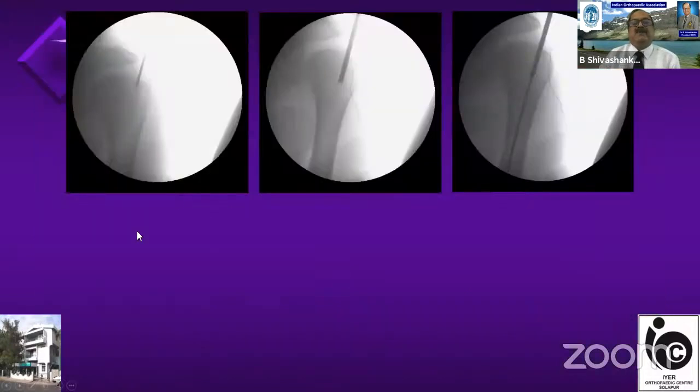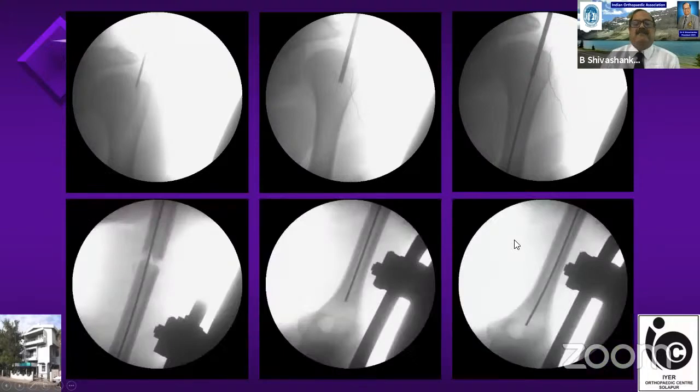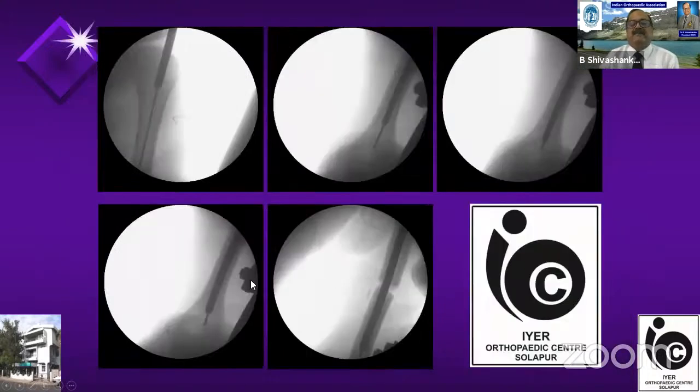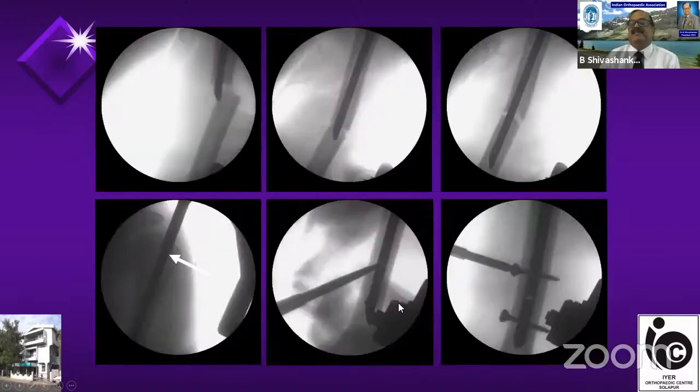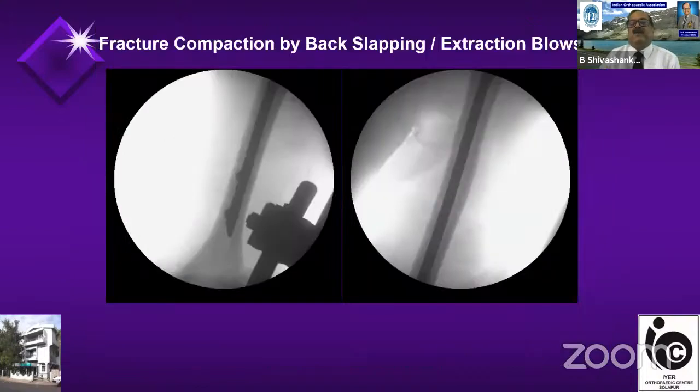And my technique, which I'll be showing in detail later, is normally this: I pass a 1.5 millimeter guide wire. Over that I pass a cannulated drill bit, then take out the guide wire and pass the guide wire for reaming. Once the guide wire goes across the fracture site, I ream the medullary canal properly, then I insert the nail and do the distal locking first, then extract the nail to compact the fracture.